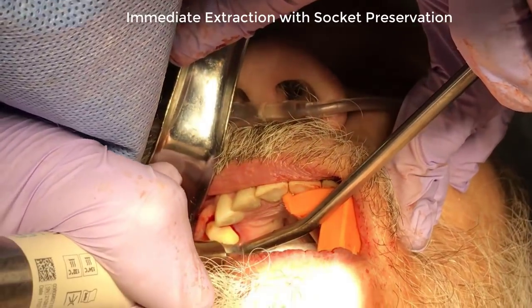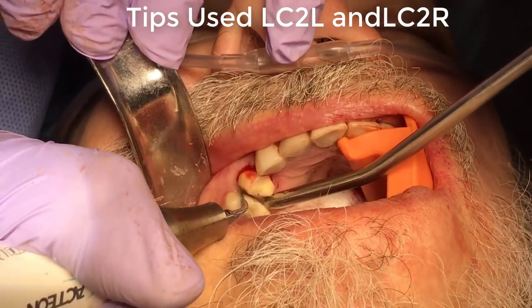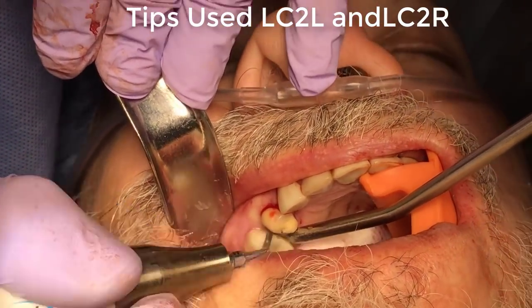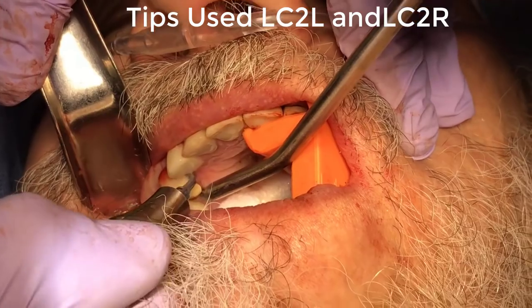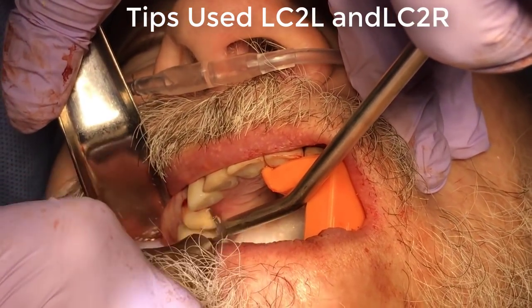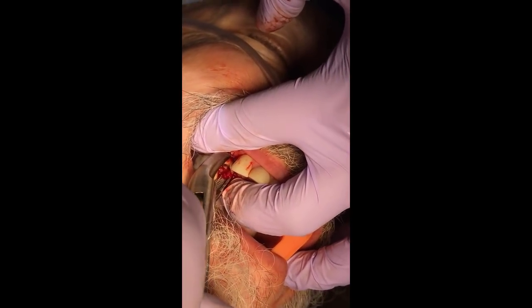The important aspect of this technique is to perform these vertical osteotomies, join them, and stay as close to the root surface as possible in the PDL space — much like you would do with a manual periatome for the extraction. Utilizing this technique is very efficient, and we can maintain the integrity of the extraction site, performing a very atraumatic extraction allowing us to retain the circumferential bone for either placement of implants or for immediate bone grafting.